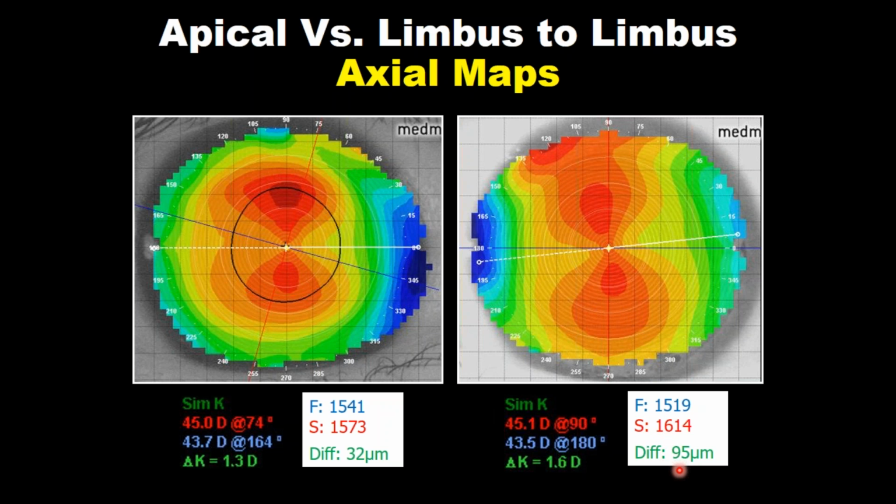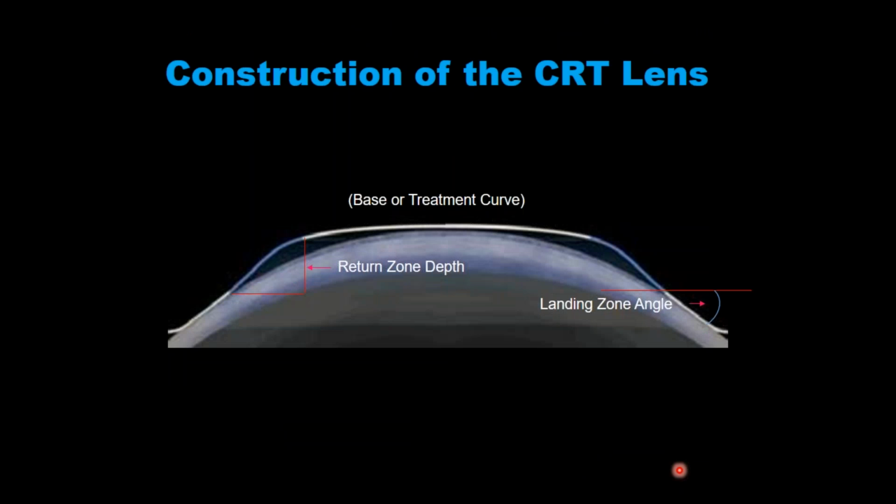The cornea is too toric out there in the periphery for a symmetric lens to work with a high percentage confidence. You're going to effectively struggle with centration and with the treatment effect, the visual effects the lens might create.